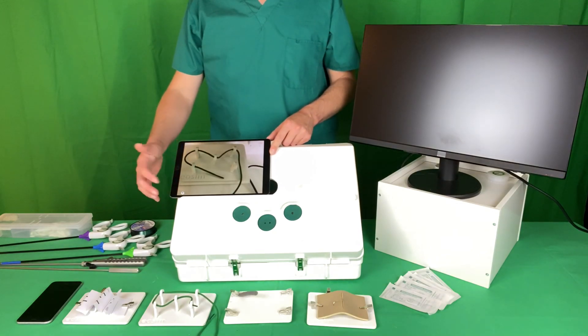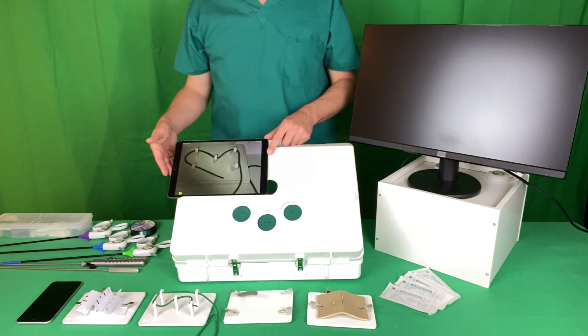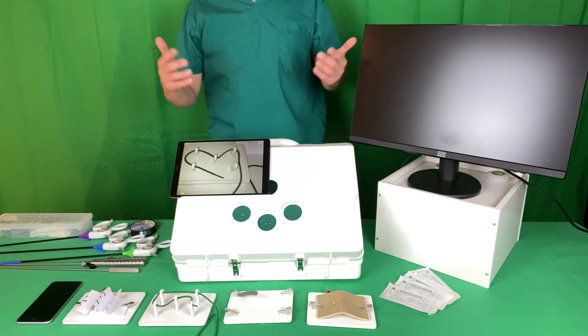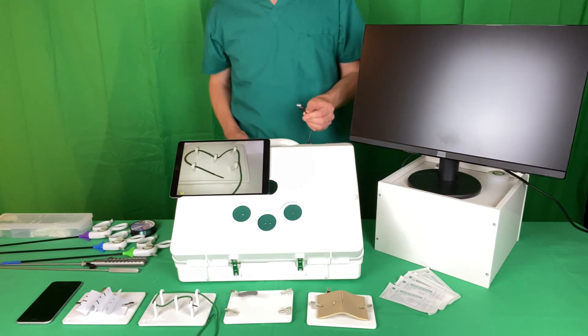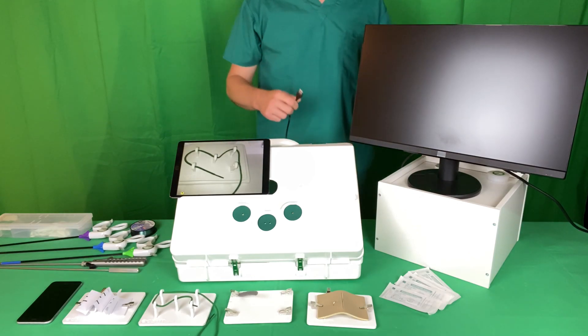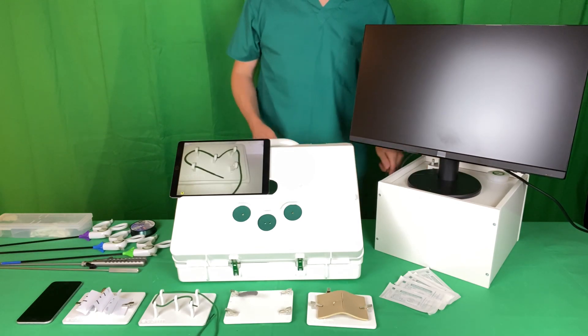If you have a flash on your device, click the button and that gives you coaxial light. If you don't have a flash, or the light is still very poor, all the units come with an LED strip on the inside which you can plug in with a USB into any USB socket on a plug or other device.